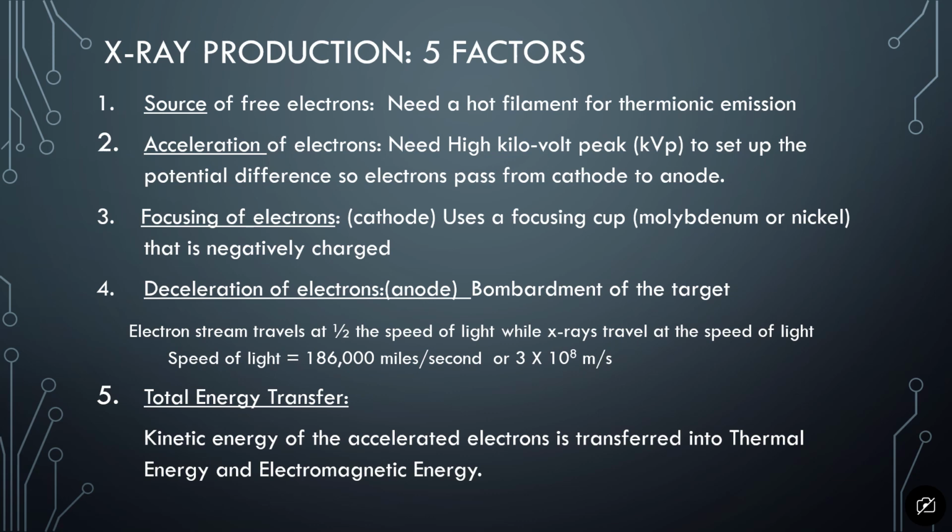And then you have a total energy transfer. This is the kinetic energy of the accelerated electrons, and it's transferred to thermal energy and electromagnetic energy.